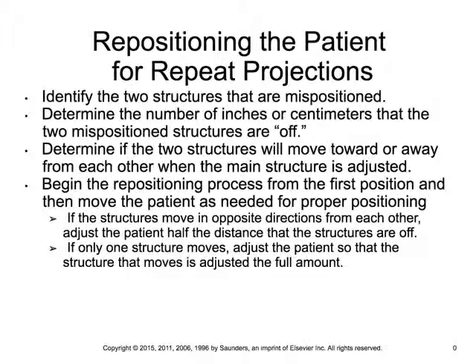Does the patient need to be turned to the right or to the left? And then typically it helps to work methodically, right? So we'll begin with the very first thing that was not quite aligned, and if we need to go from there, we'll go from there. And bear in mind, as you turn one side, the other side's turning as well, right? So normally you have to go about half the distance because you're meeting it in the middle.